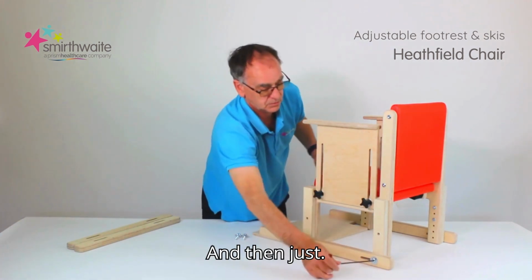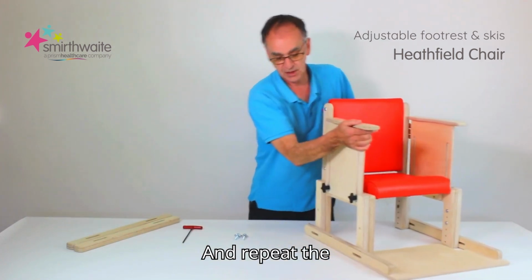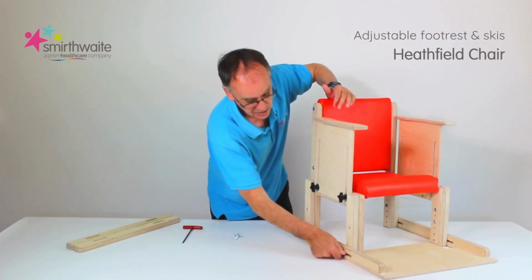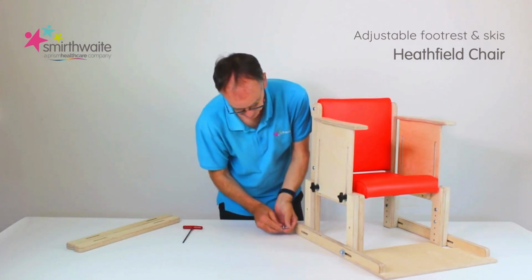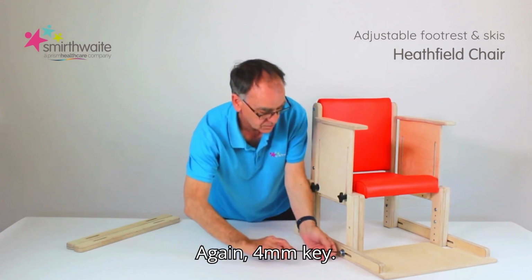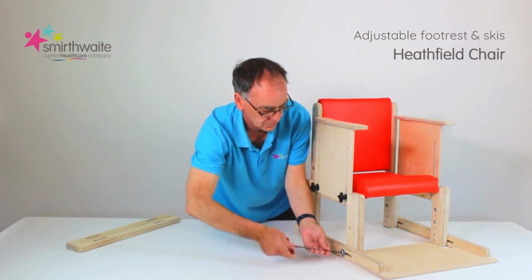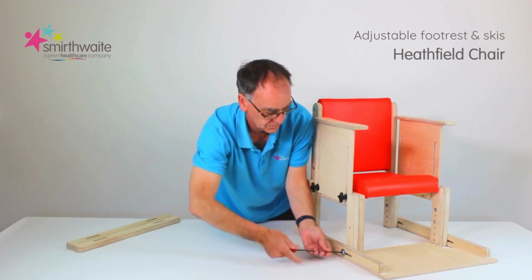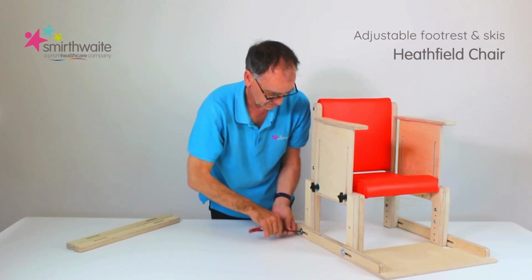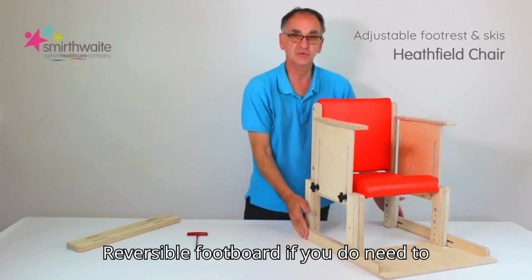And then I'll just turn the chair around and repeat the procedure on this side. Again, 4mm key. And tighten them up. And you've now fitted a reversible footboard.